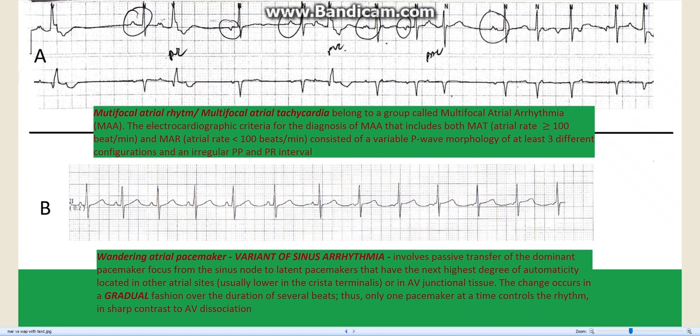Wandering atrial pacemaker, or WAP, is a variant of sinus arrhythmia. It involves the passive transfer of the dominant pacemaker focus from the sinus node to a latent pacemaker. So what you see on the surface EKG is that the change will occur in a gradual fashion.